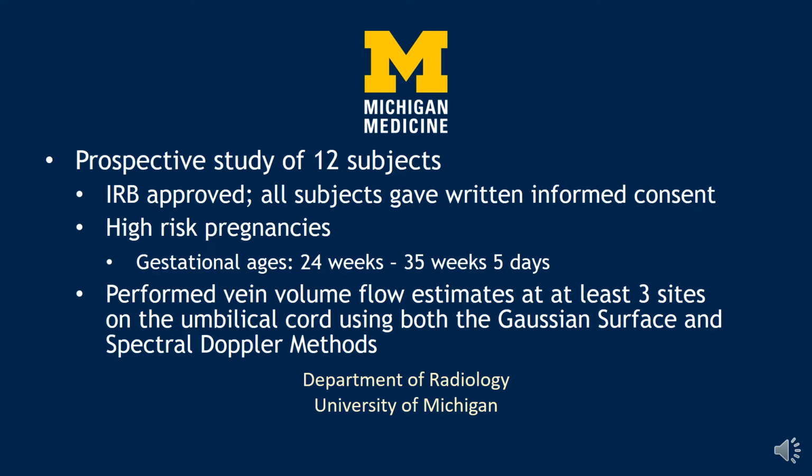So the study is a prospective study of 12 subjects. It was IRB approved. All subjects gave written informed consent. They were all high-risk pregnancies, with gestational ages from 24 weeks to 35 weeks, 5 days. The reason we used high-risk pregnancies was that they were in the hospital and were being monitored for their pregnancies. So they were very willing to participate because they had lots of time on their hands.